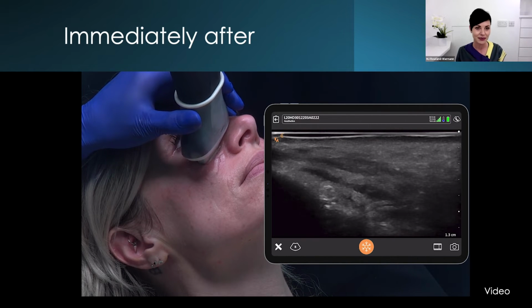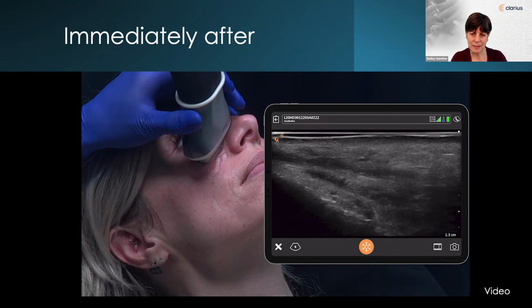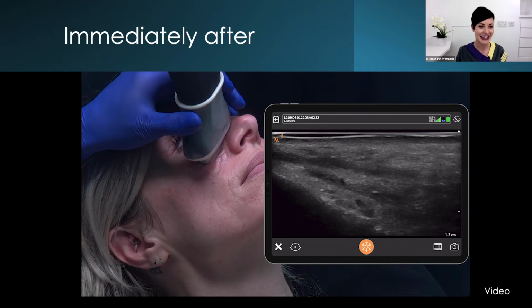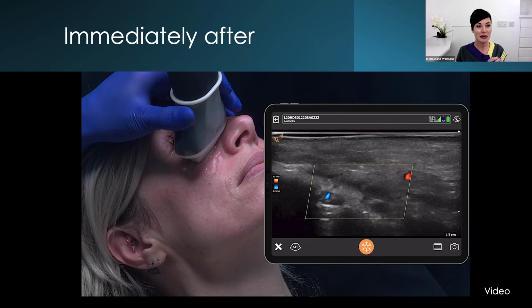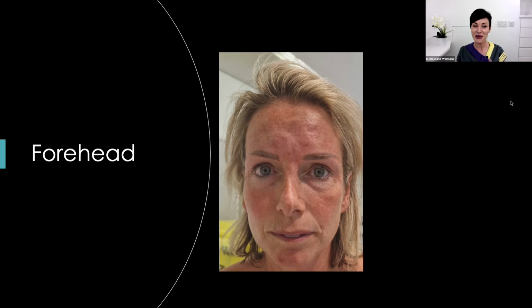of weeks. And in a couple of weeks, would you still see that cotton wool appearance? I'm going to share something with you in a second. But no, that cotton wool appearance disappears probably about 20 minutes, half an hour afterwards. More on that later. So this is our second patient.